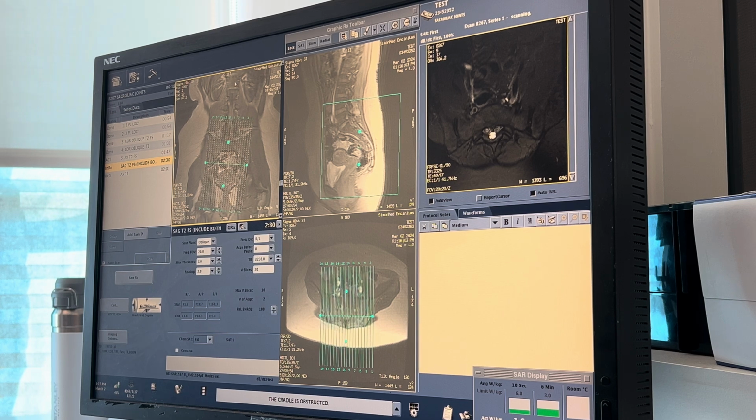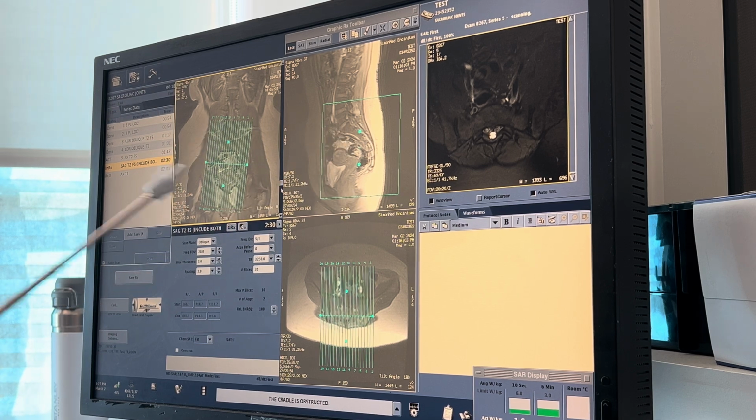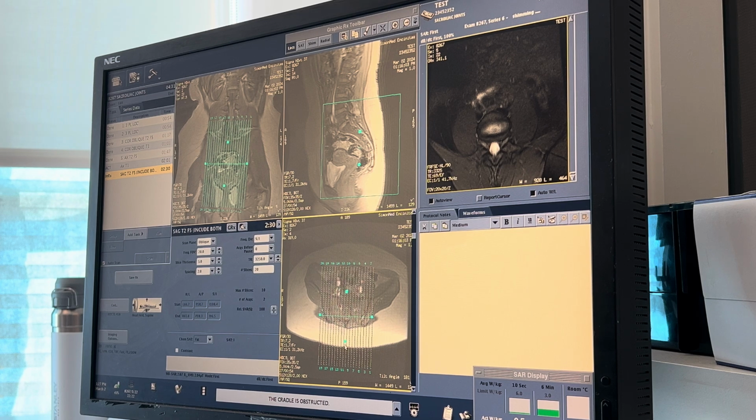A little bit more. Yeah, okay, perfect. You angled it with that already. Okay, so now we have our FOV. It looks centered. You angled over here. I'd go a little bit less. To the right? To the left, I would say. Yeah, there you go. Okay. And finally, let's angle down here. Perfect. Okay, so now everything looks good.